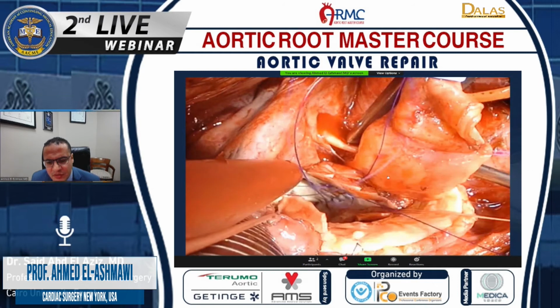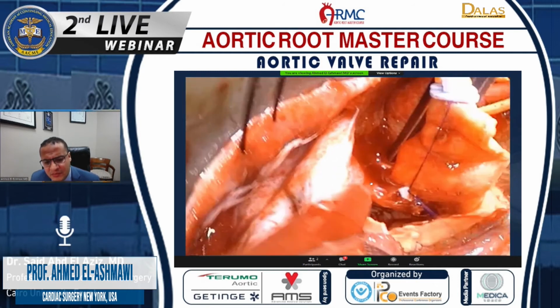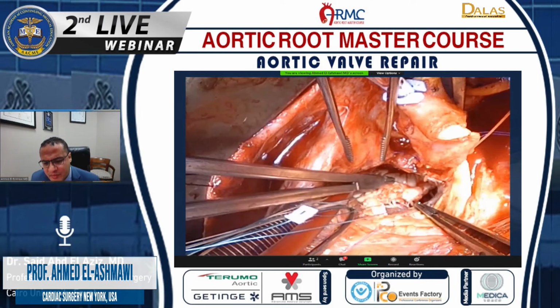This is easy because we didn't want to dissect the lateral wall of the heart to clip the appendage. We then proceeded with the mitral valve replacement. Here you see we left some of the calcium.